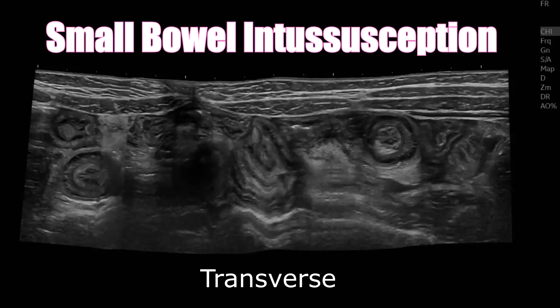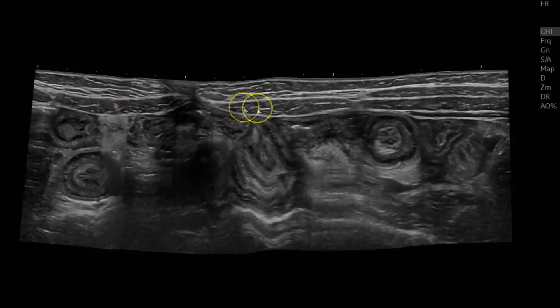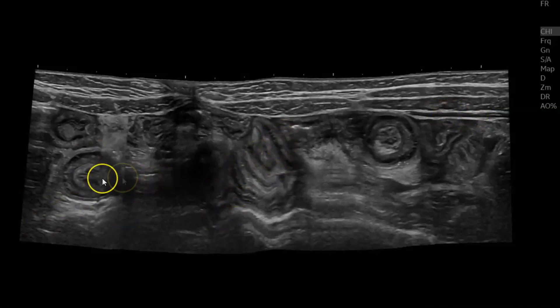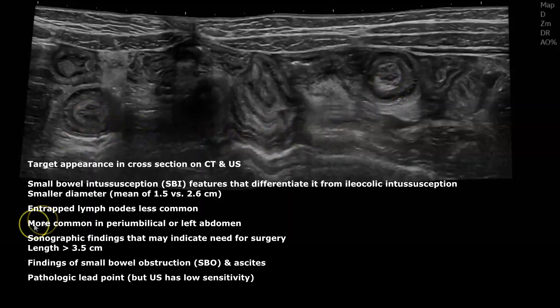Here we have a transverse panoramic view of the lower abdomen. You can see there's an intussusception here and another intussusception here — this is about the level of the umbilicus. Here you can see the rectus abdominis muscles and the external, internal oblique, and transversus abdominis muscles. These are examples of small bowel wall thickening causing small bowel intussusceptions. We know they're small bowel intussusceptions because of the size — they're both about 1.9 centimeters — and location.